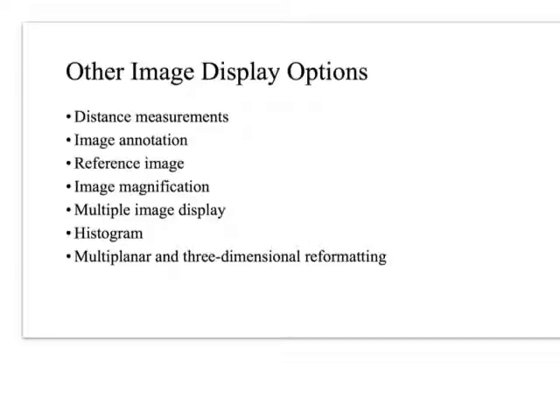She has a lateral L-spine, and she's created this reference image using the scout image. She's overlaid where the different slices were taken, right? And this is very useful because now I have an easy way to see where I'm at in the z-axis on this other image. So I can say that is definitely, for example, L4 or whatever it is, because I don't need to run up and down on it. I can just look and see, okay, I can count down L4 right here, right? I'm just saying, for example.